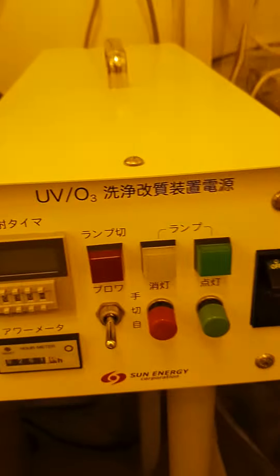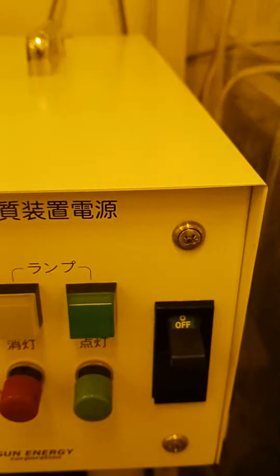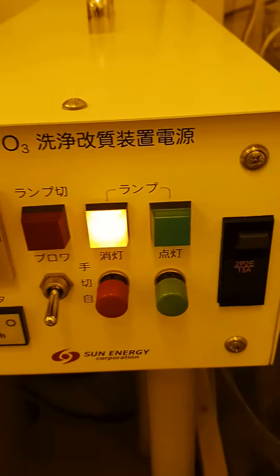This is part of this machine. Now I am talking about how to use it. First, turn on the switch — this is the switch. So now the switch is on.